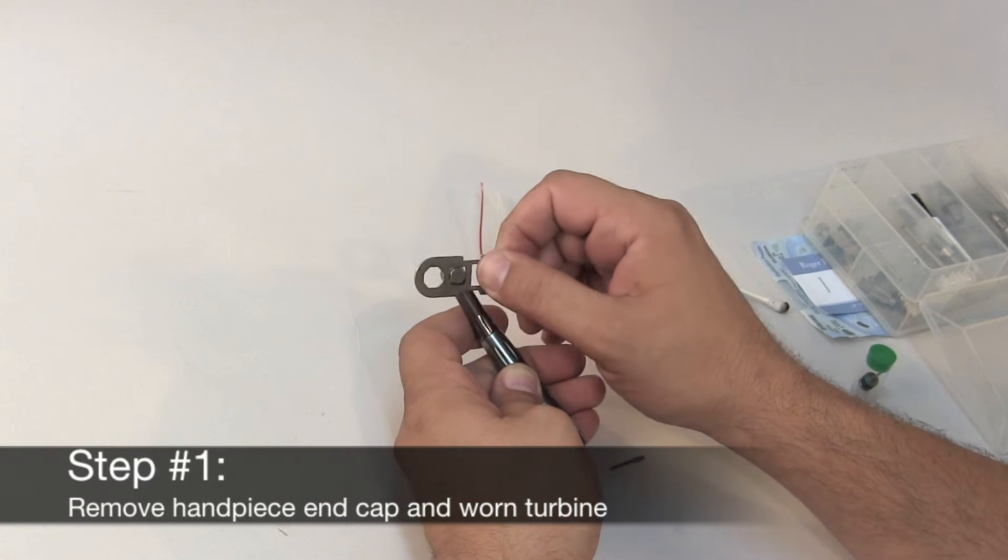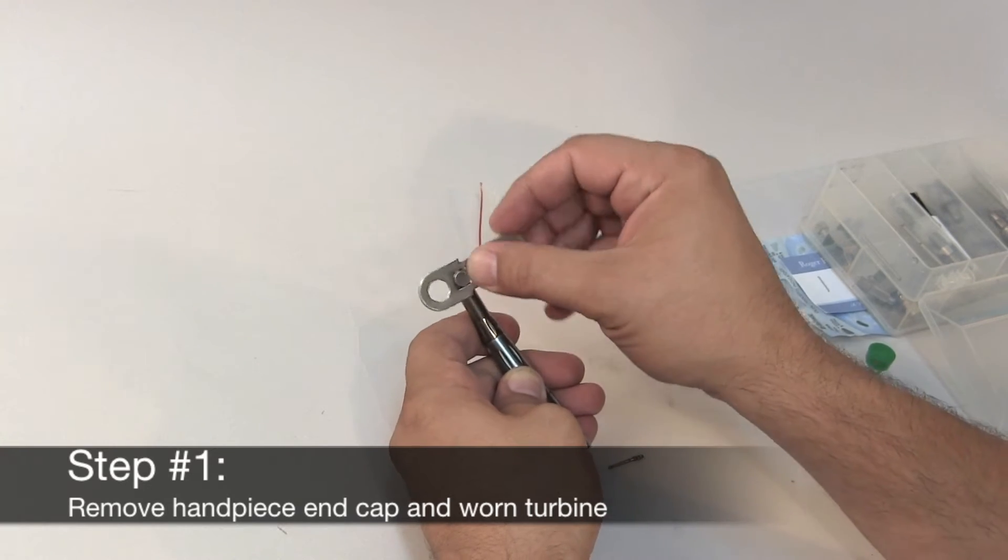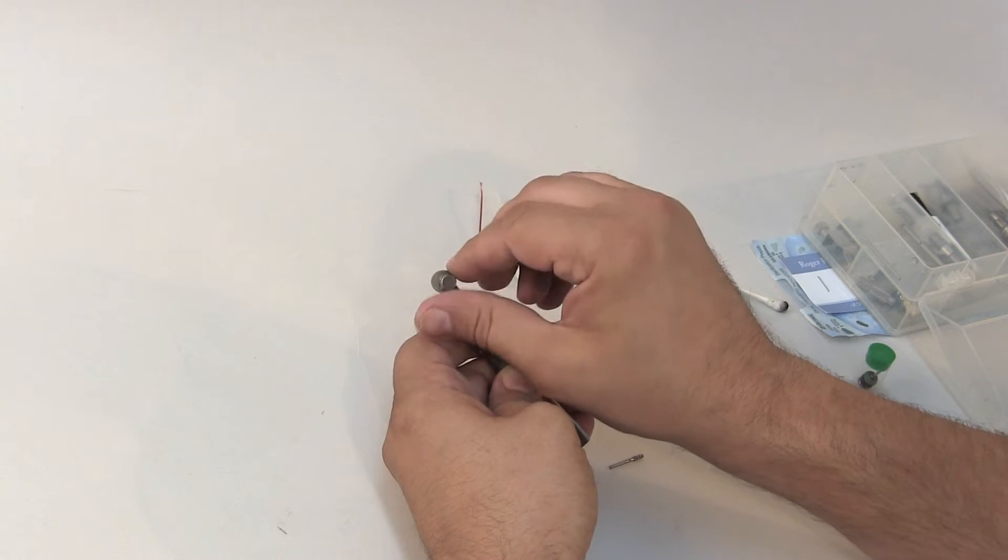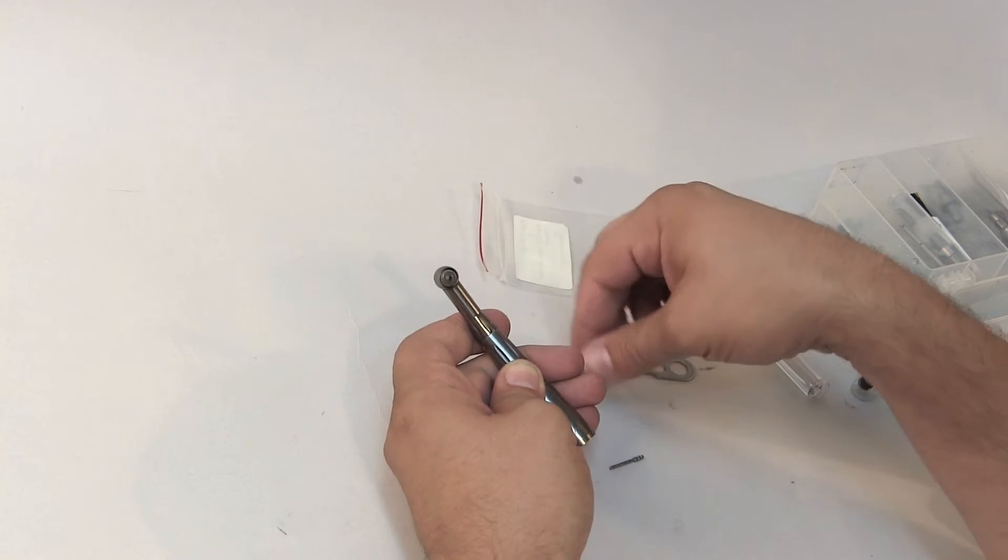Using the specialized wrench provided with your handpiece, unscrew the end cap from the handpiece head and remove the worn turbine by pushing out from the front. Don't use pliers or other inappropriate tools, it will damage your handpiece.